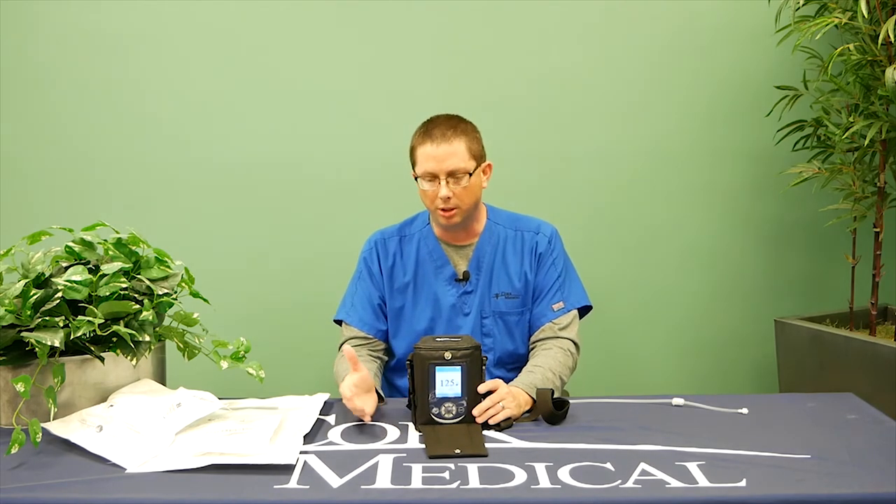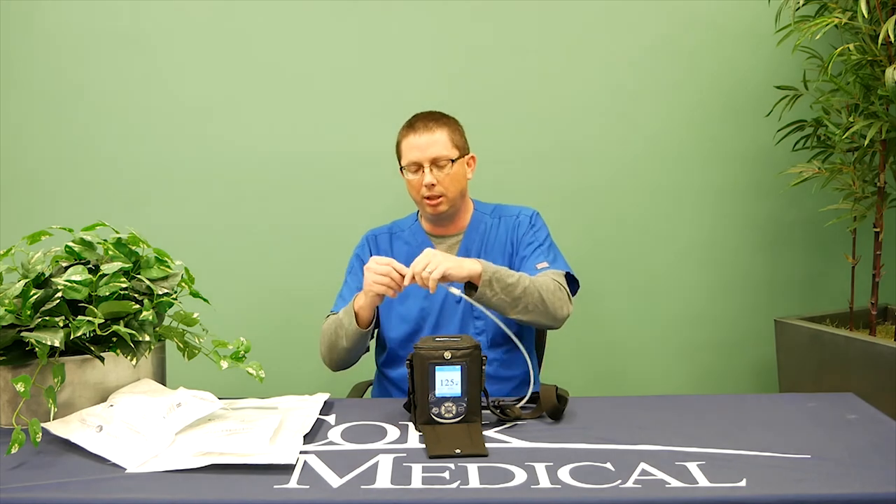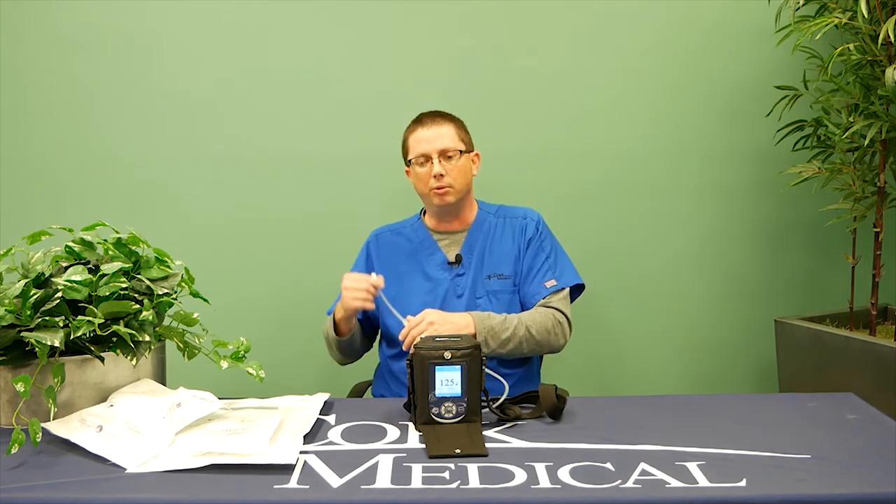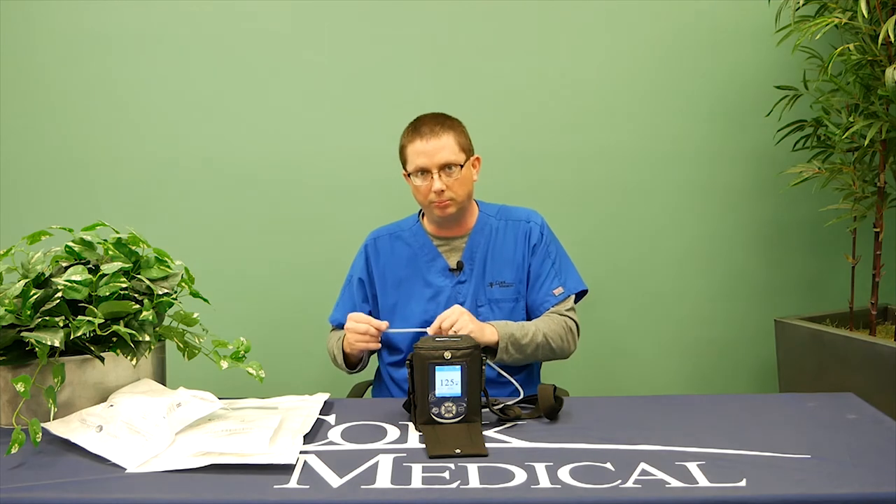Another common question: how do I get dressed if I have a lower leg wound and have tubing running through my pants? Clamp your tubing on the canister side, clamp your tubing on the dressing side, disconnect and run it through, then reconnect and unclamp both clamps. This allows you to get dressed if you have a lower extremity wound that requires the tubing to be disconnected.